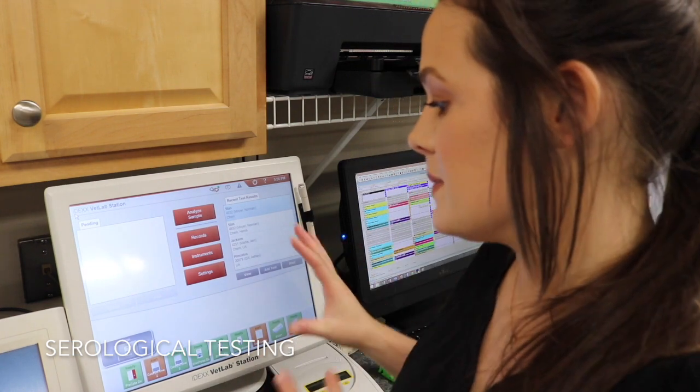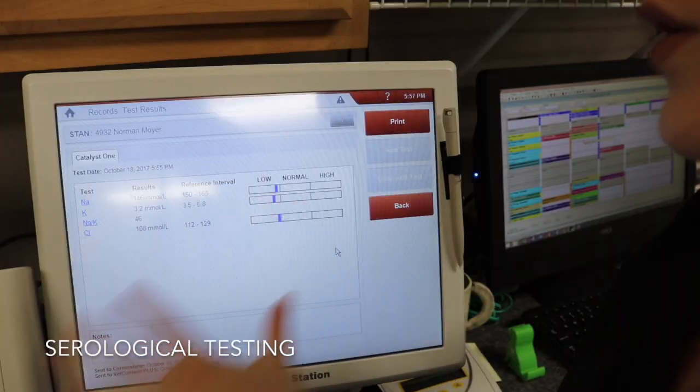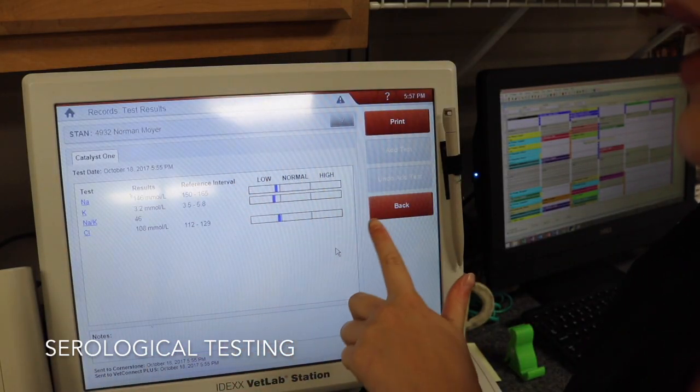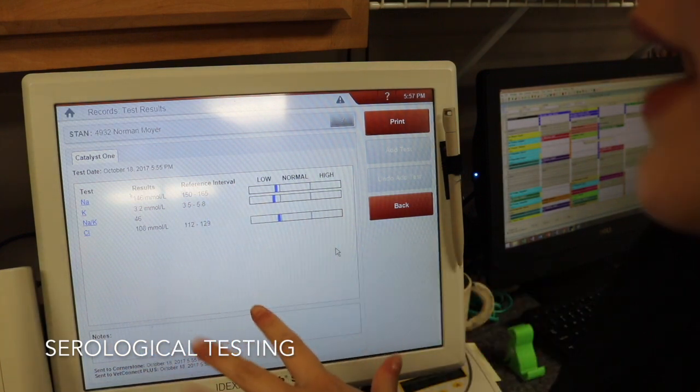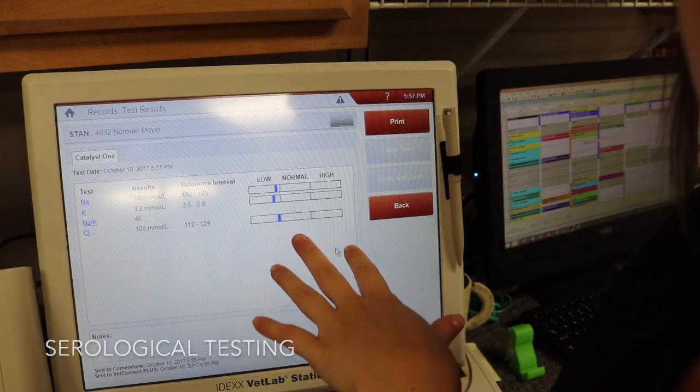Once my blood chemistries are done processing, the results come to this machine where you can view them — it will also automatically print out as well. For these electrolytes this is my reference range: I have a low, normal, and high. This guy's electrolytes are a little bit low. It shows the exact numbers and the reference intervals, and also a visual scale.